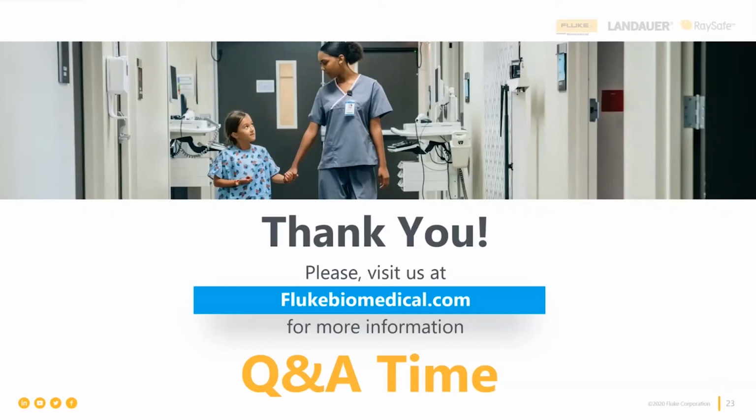Now, here's the problem. Some AEDs have a battery that is replaced along with the pads. And so your testing will need to have an extra pair of pads and that extra battery, and that battery is not rechargeable. So that means when you've done your testing, the pads and the battery get thrown away just like they would if this AED was used to defibrillate a patient. Same deal, the pads and the battery both get thrown away.